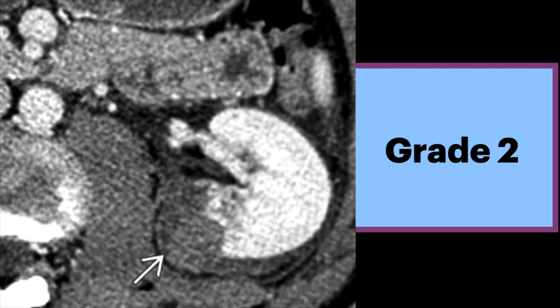In this axial CT during the corticomedullary phase, there is a hematoma in the left kidney whose size is consistent with a grade 2 injury.